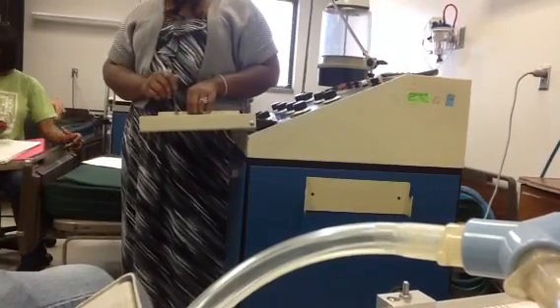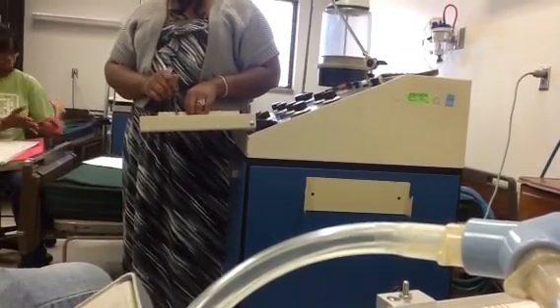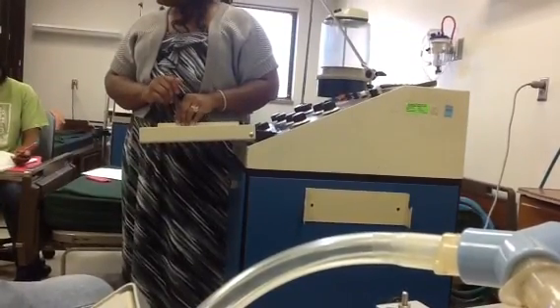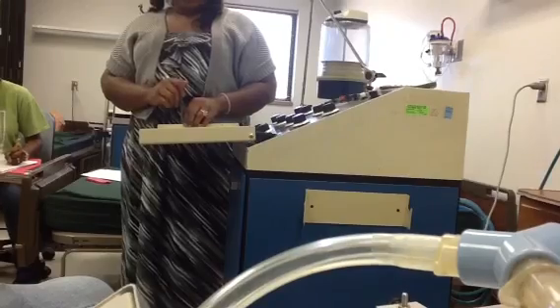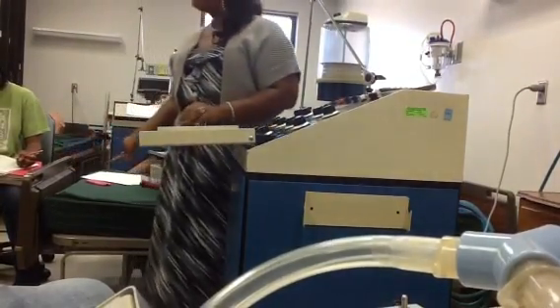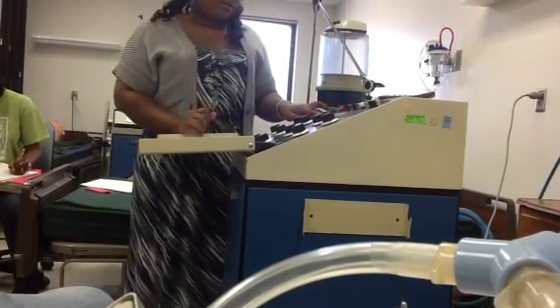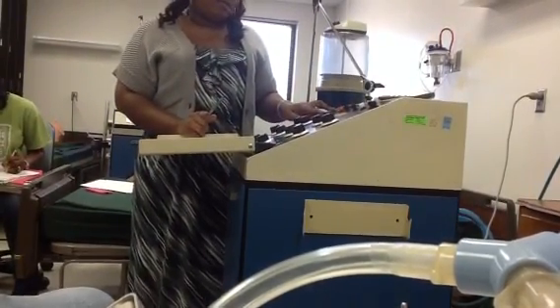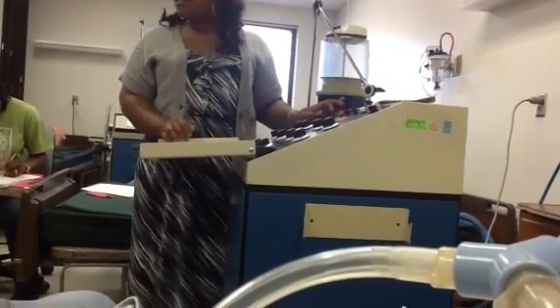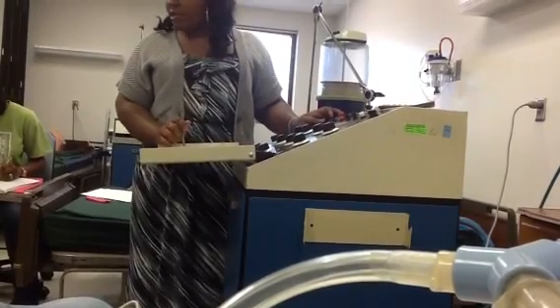Oh, 0.007. Okay. And now you calculate your volume loss because you're on the patient and you can get the PIP on the patient. So you watch for a normal breath, not a sigh breath. It's 15. It's the PIP. You watch the pressure and see where it goes up to. So now you calculate volume loss.